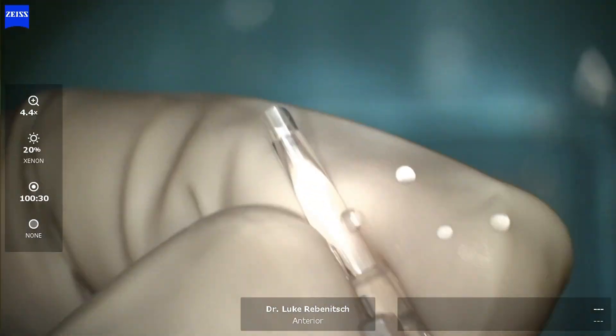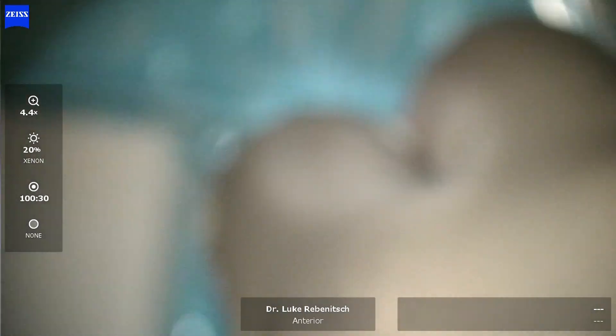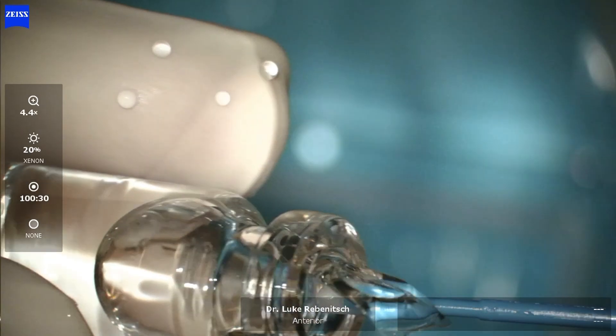Here we're getting the inserter ready, replacing both a saline solution as well as OVD. This is a jelly-like substance that helps keep the lens protected as well as for use inside the eye.